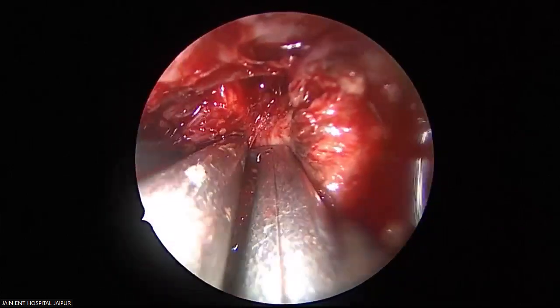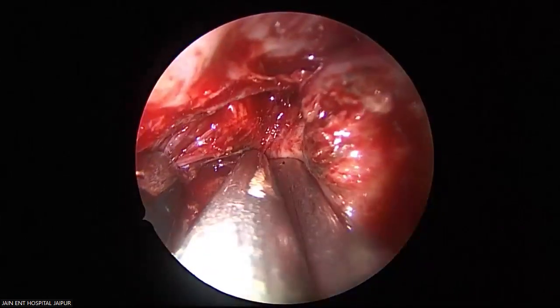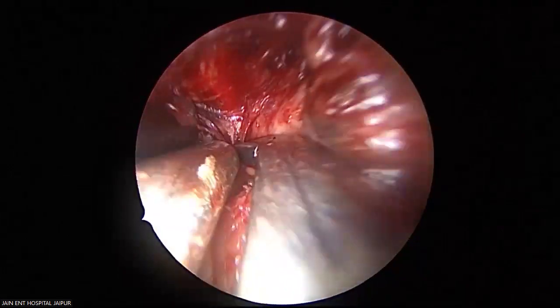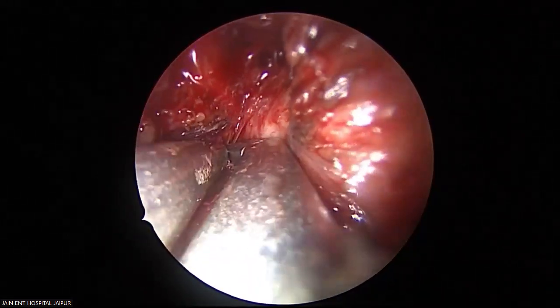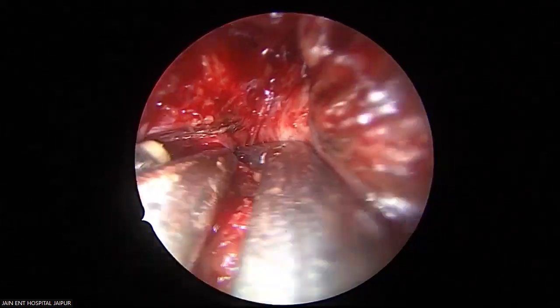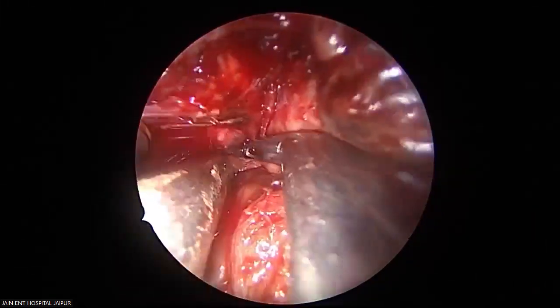This is the vessel, here on the upper lateral part. That's the main vessel. Can you see the vessel?